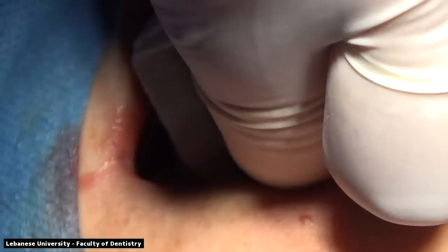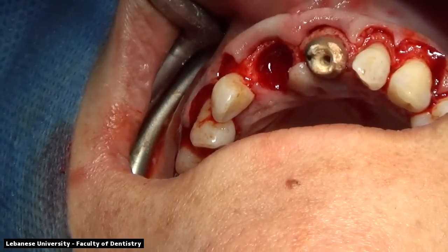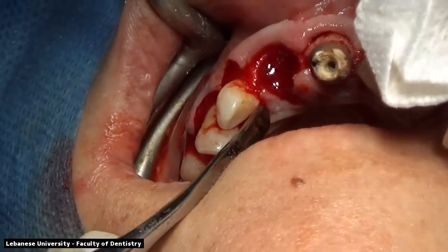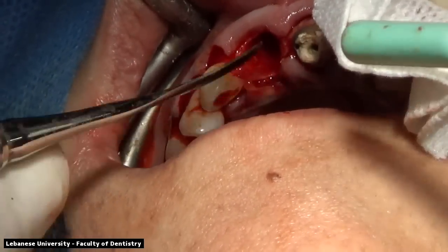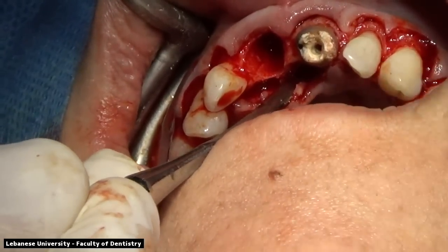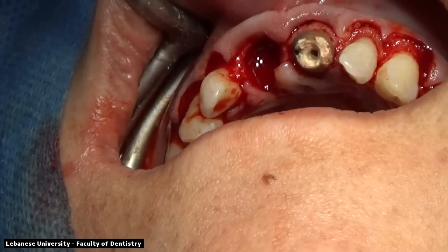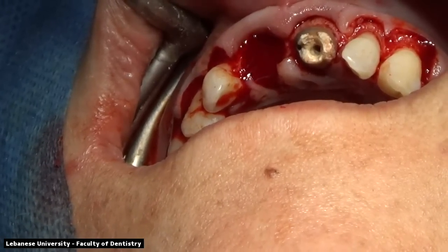On the palatal side, we're drying up the area so that we can see the palatal side as well. So we're going to reflect the palatal flap so that we can see the socket itself in all directions. We're trying our best not to remove all the blood at the site, so we're trying not to suction a lot. And we can see that the palatal and the buccal walls are on the same level. We have an intact socket on all four sides with very thick soft tissue and very thick buccal plate of bone.